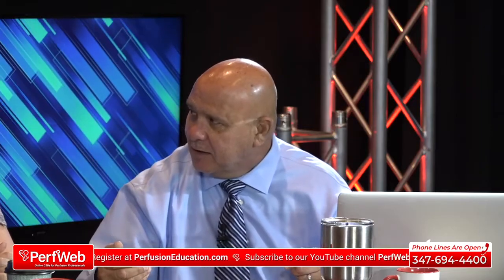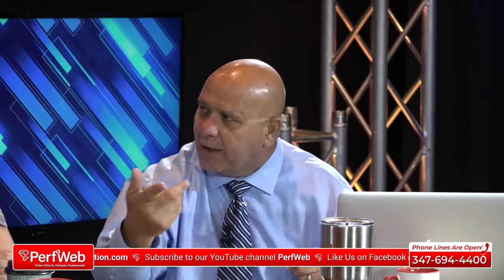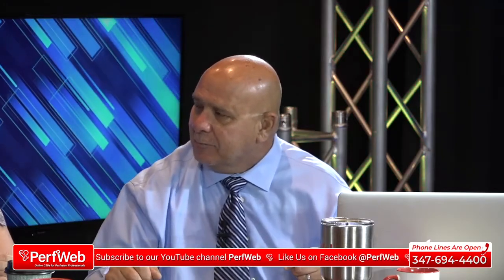I think this one still has a lumen, but it's teeny. It's just enough to get the wire through, and that's it for insertion. But it's horrible. And when it doesn't work on the balloon console, it's a mess. But again, the balloon pump is being timed in automatic mode from the data being received from this fiber optic, which is very finicky. And yet the balloon pump can do harm. It's not a benign device.